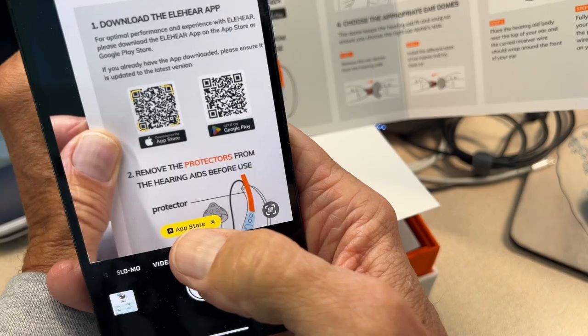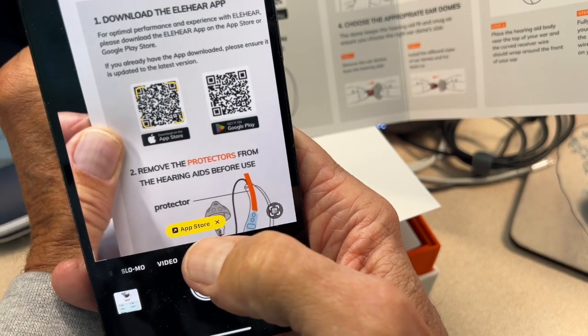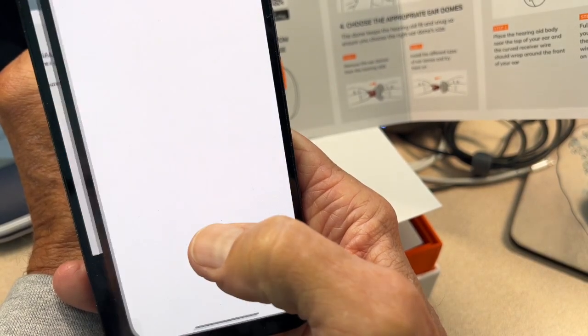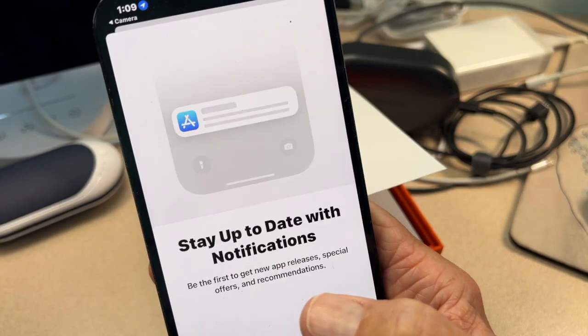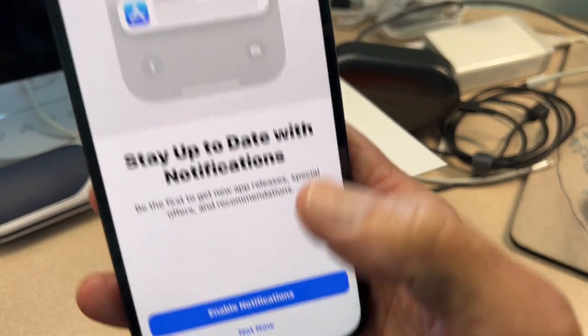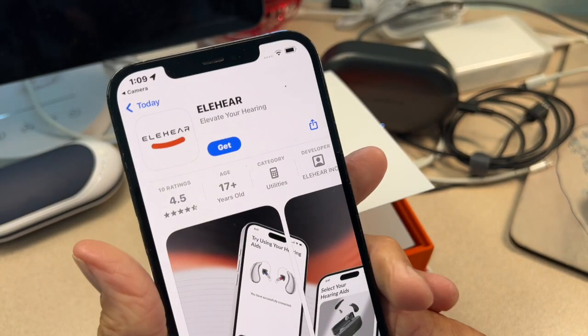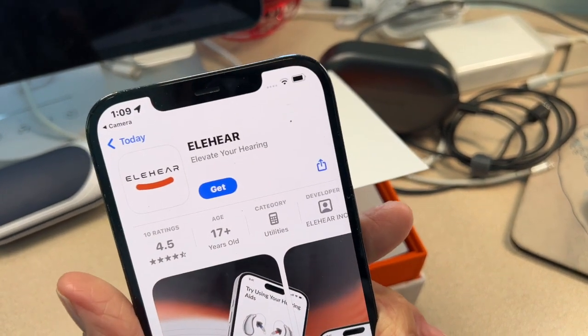You see that yellow square, and then you see that little yellow thing at the bottom. It's on Photo. And I just click it. And it's going to take me right to the app. Okay? And look, I don't want to do that. All right, so now I'm at the ELEHEAR app.